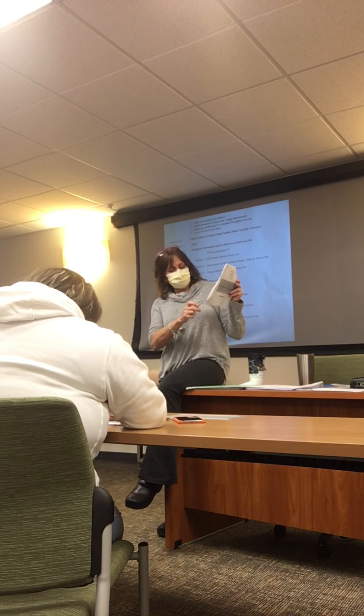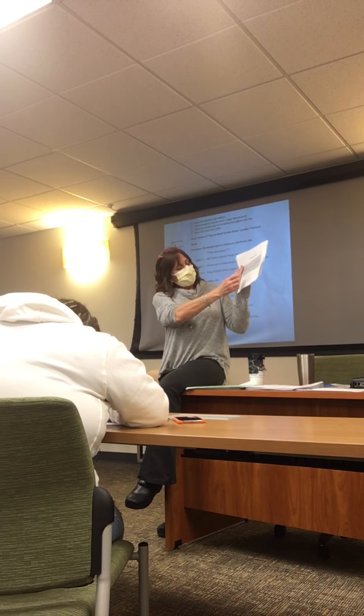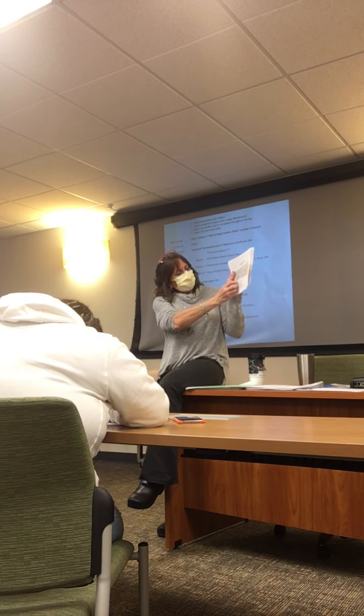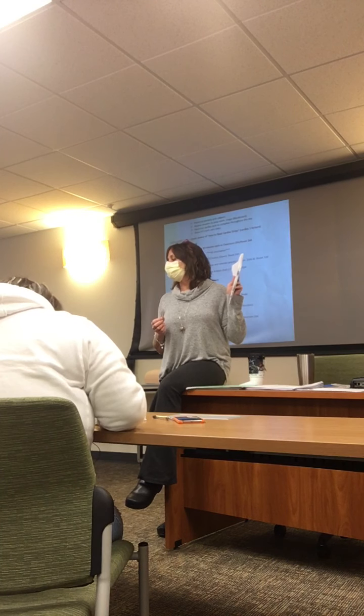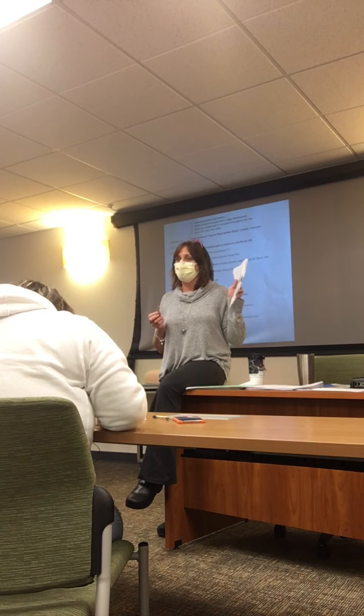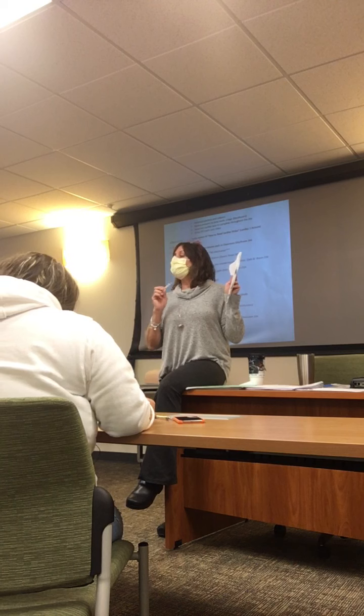My QRS complexes. So I'm going to take my calipers and measure from the beginning of the QRS complex till the end. How many? 2 little boxes. So my QRS complex is 2 times 0.04, 0.08. Is that normal? Yes.